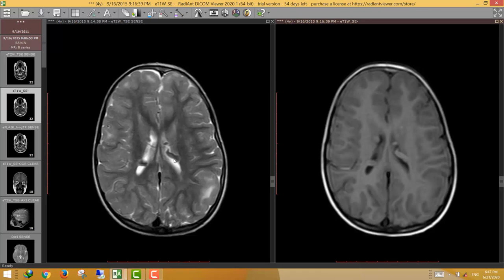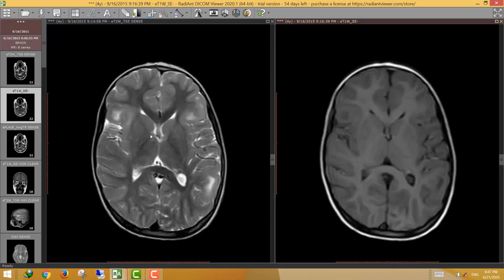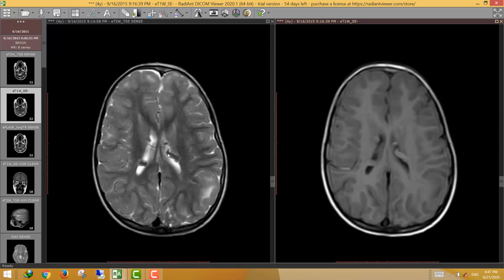The typical location of subependymal giant cell astrocytoma is the foramen of Monro. Although this nodule does not show the typical location of SEGA, the size is large and suspicious for SEGA, even though it shows an atypical site for the neoplasm.